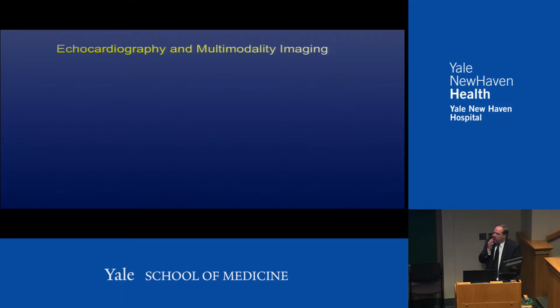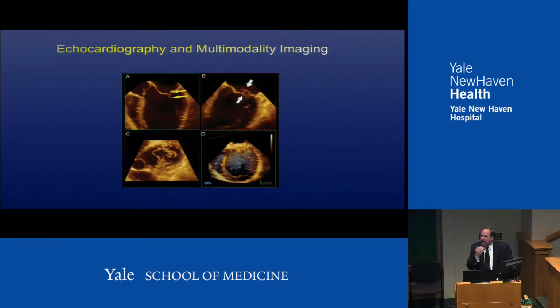So where do we move into the echocardiography world? We all know that with 3D TE, you can get nice images. So you can see structures in orthogonal views. You can see the three-dimensional view, but how do we use that?